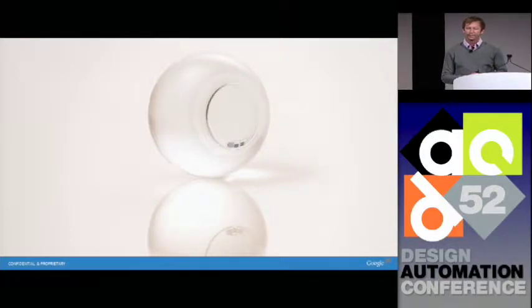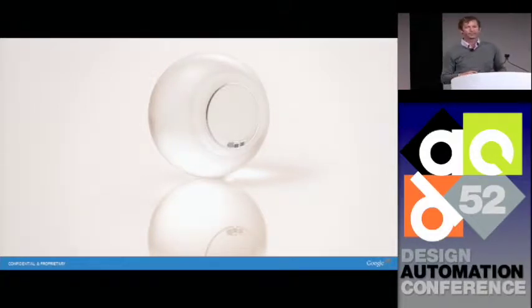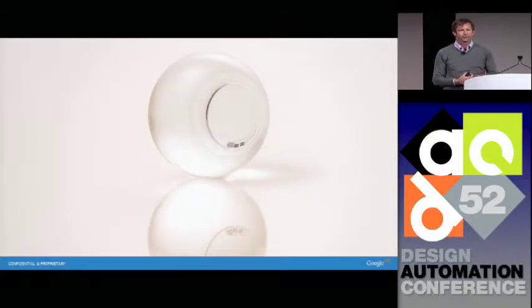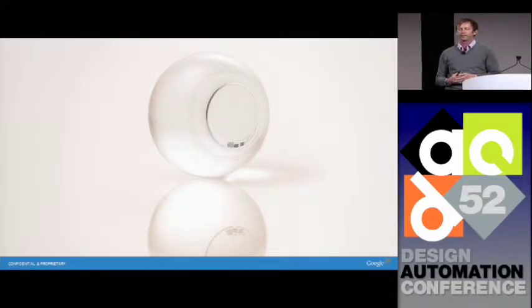One thing that we've been thinking a lot about is camouflaging the device, adding different types of color to the antenna lens that would match the iris color. Even though I think it looks pretty cool to wear one of these devices, not everybody would think that way. The diabetes technology community and people who have diabetes are actually quite sensitive to this. This is one of the problems with pricking your finger, for example. You simply don't want to sit down for dinner and then pull out your lancet, pull out your alcohol wipe, prick your finger, take out your meter. People want this routine to be very private. And that's something that we need to respect with the technology that we create as well.